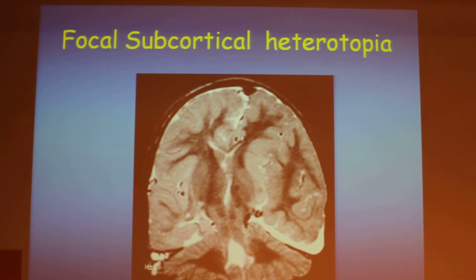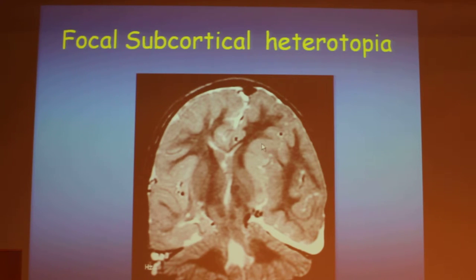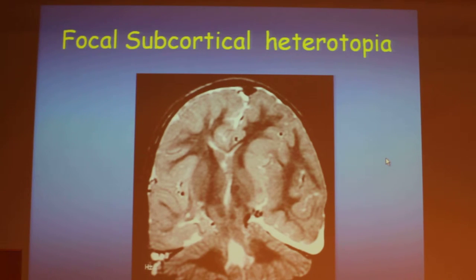However, sometimes they actually look like a mass. This ectopic gray matter even causes a mass effect on the ventricle and the folds. And again, what we have to do is prove to ourselves that this is gray matter in all sequences.